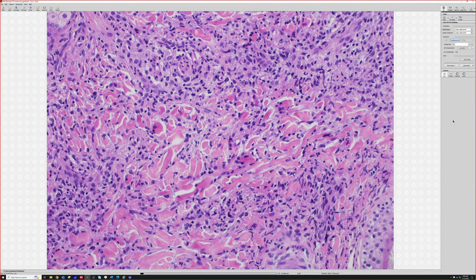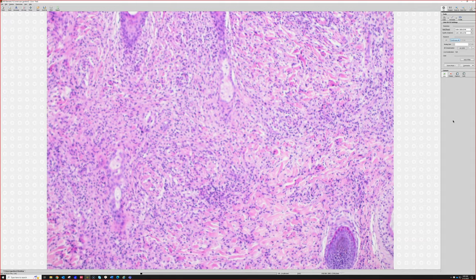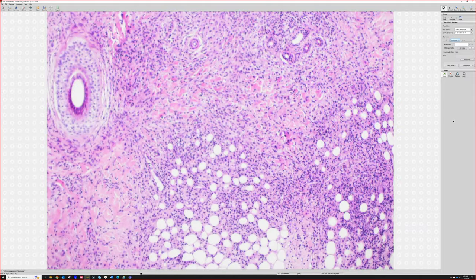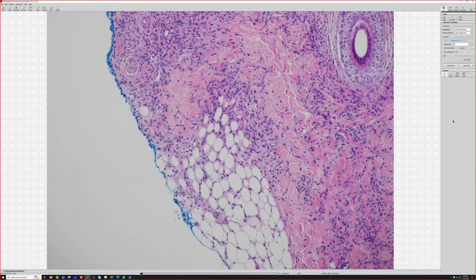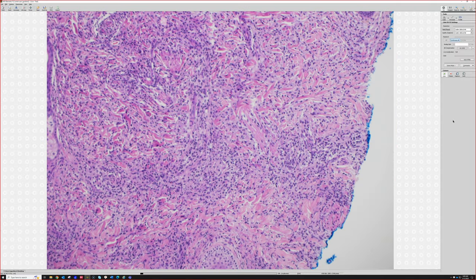This is hard because it's missing the one feature that, if I showed you, you guys would all be like, oh, easy, no problem. But that's why it's good to see cases like this, because in real life, you sometimes are missing the feature. Is it JXG? Very good. This is a juvenile xanthogranuloma, aka solitary xanthogranuloma, because they occur in adults sometimes. So I don't know that this was on a kid's face.